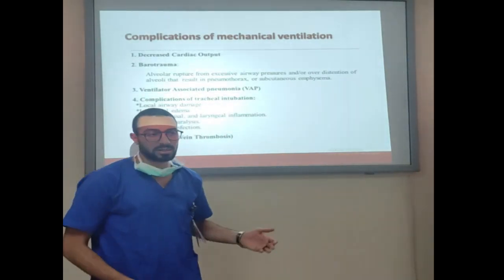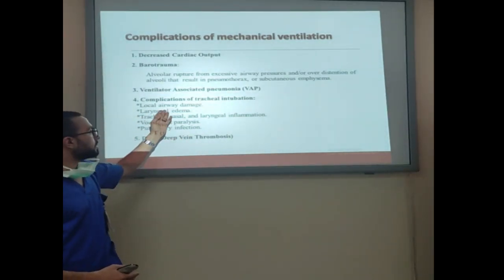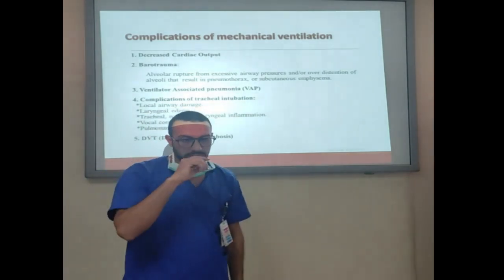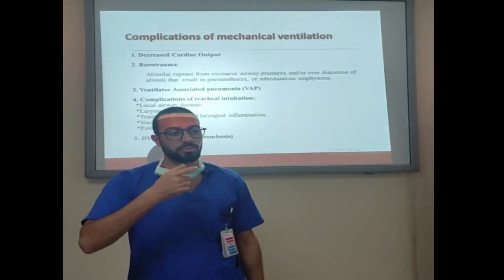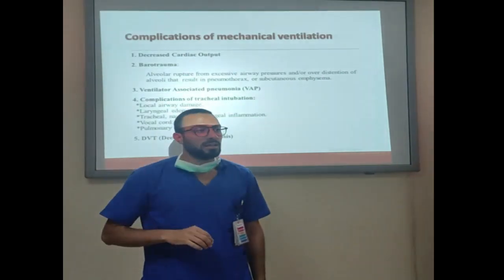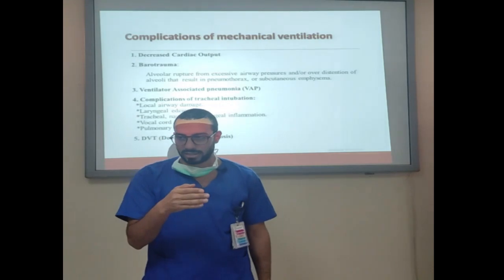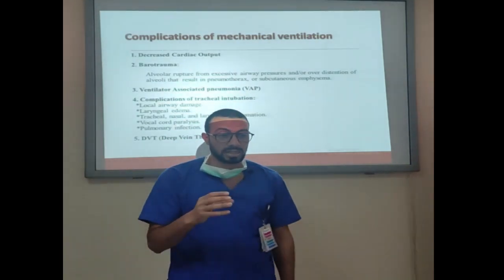We will talk about it in the nursing care. Complications of tracheal intubation. Tracheal intubation, by the way, we have in the endotracheal tube a cuff, and we should inflate the cuff. So let me ask you another question. It seems to be unconnected, but it's totally connected to our topic today.